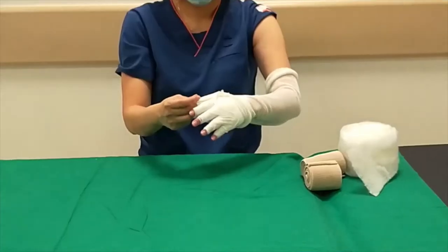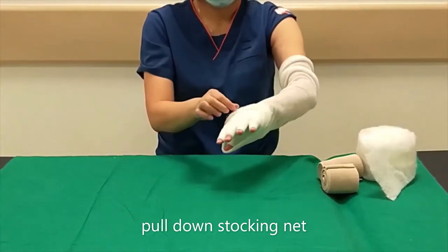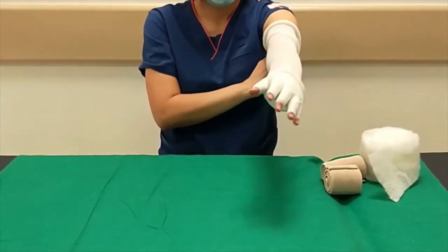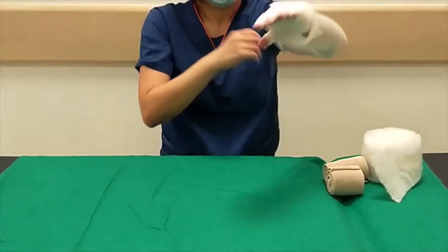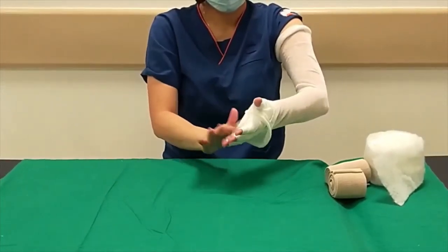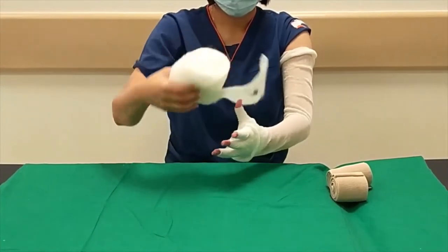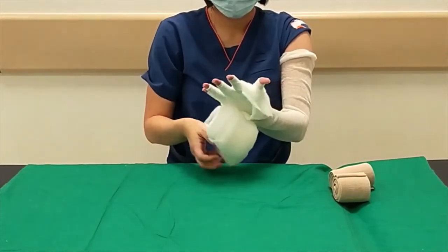The stocking net is then pulled down over the hand and the thumb is placed through the hole. Take a 10cm cotton padding and put in the thumb, beginning on the palm.